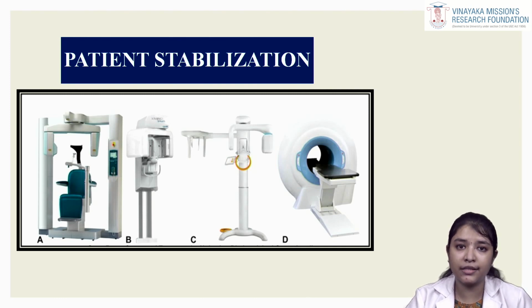In the standing position, the disadvantage is that if the patient is short, the height cannot be reduced to a lower level. The sitting position is the most comfortable and preferred position for exposure. But whatever the design of the unit, the most important thing is head stabilization. The head is stabilized by head stabilizers, or a bite fork or chin cup is used to stabilize the head, so as to prevent artifacts.